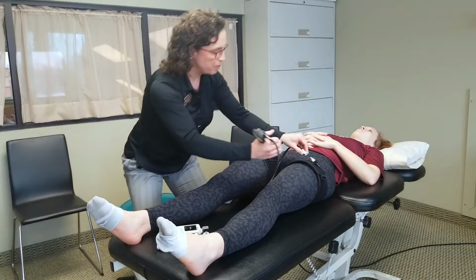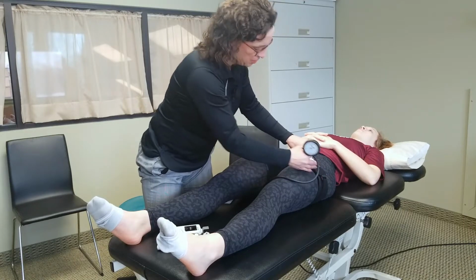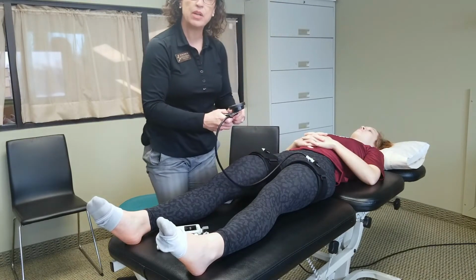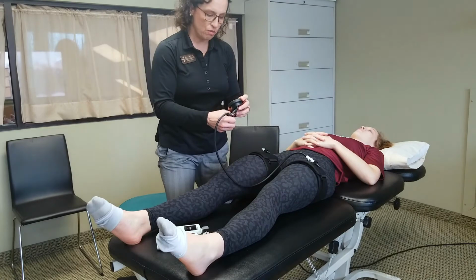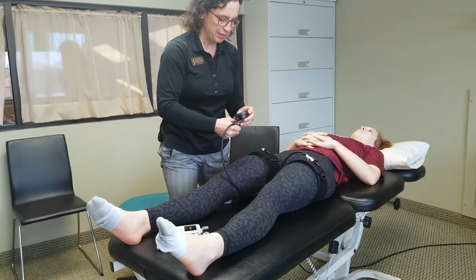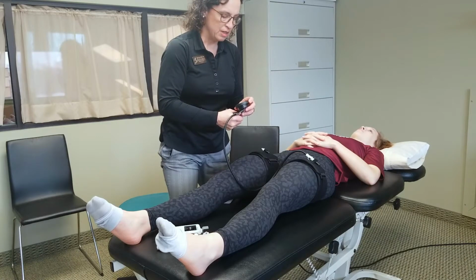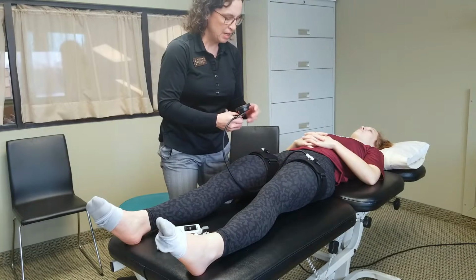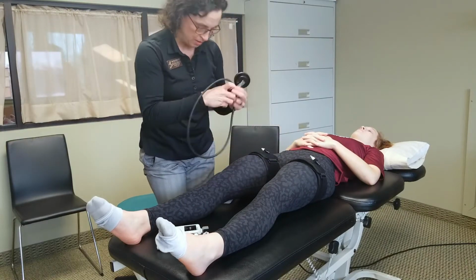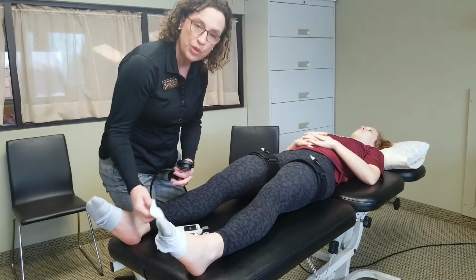Then I'm going to pump up the other leg. And for the sake of demonstration today, I'm just going to take her straight up to 120, but you would normally reassess the other leg for its max occlusion as well. Good. Right there. Get some gel off of her leg. And Rachel's going to start some bridging activities.